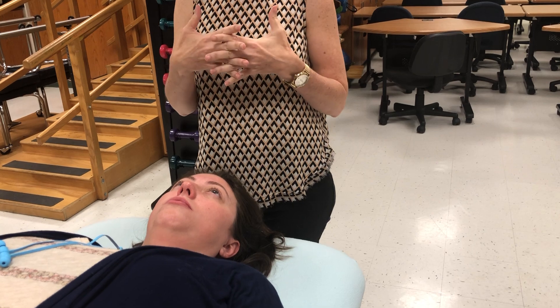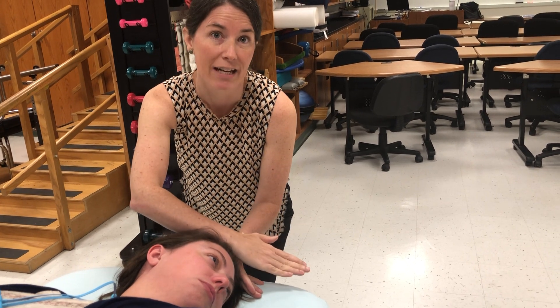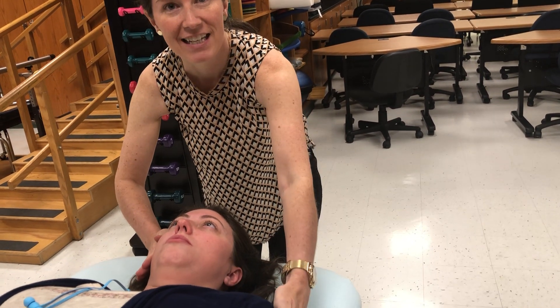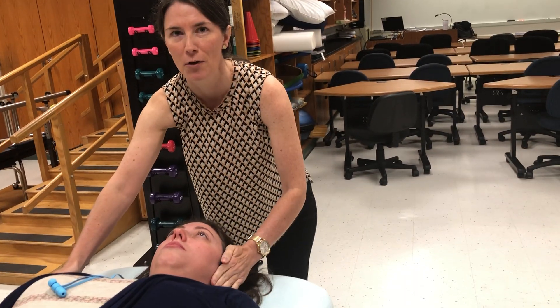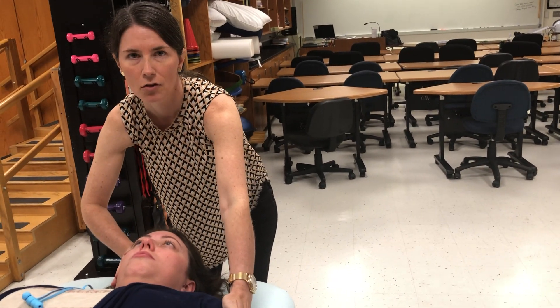It is possible to mix up the 3s, 4s, and 5s by saying: turn all the way to the right and then all the way to the left. She did from here to here — that's her grade 3 — and then kept going to get into her starting position for right rotation and then back up to the ceiling, so she just did grade 3 for right and left. Then you could do: don't let me turn you to the right, stay strong; don't let me turn you to the left, stay strong. But if you choose to use that method in a comp test, be prepared for your proctor to ask which side are you testing. You still have to know that this is testing left cervical rotation strength and that this is testing right cervical rotation strength.